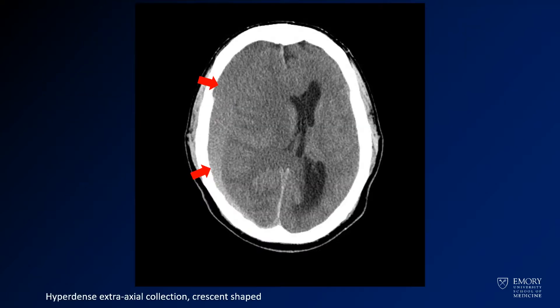Here you see the crescent-shaped collection outside of the brain along the inner portion of the calvarium. It's definitely crescent-shaped, it's definitely crossing sutures, and it's definitely along the falcine reflections of the dura there.